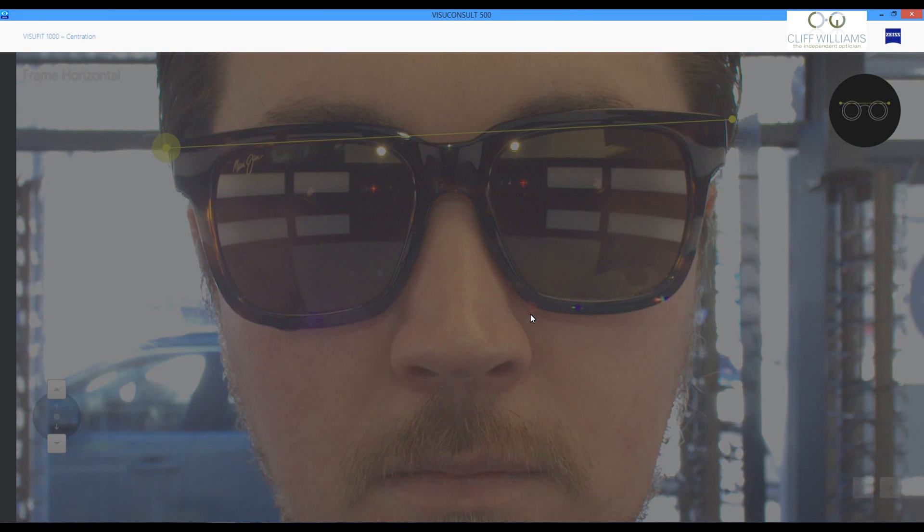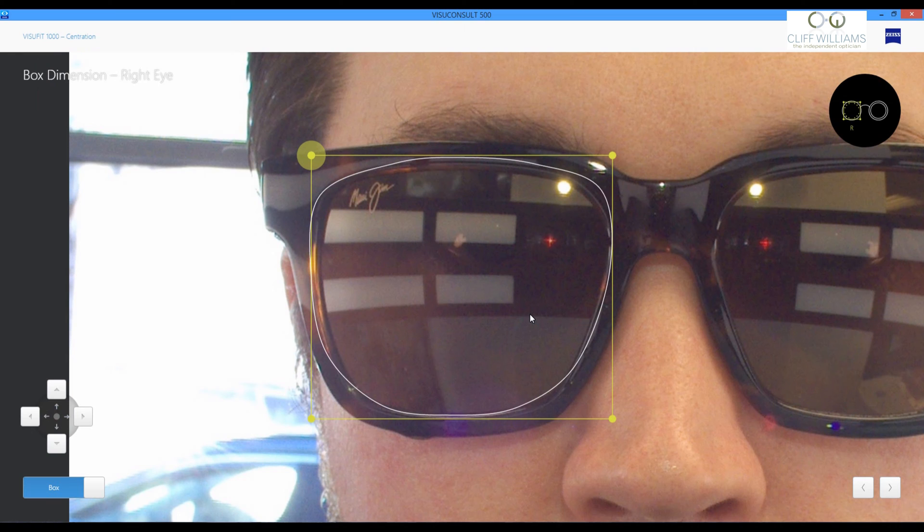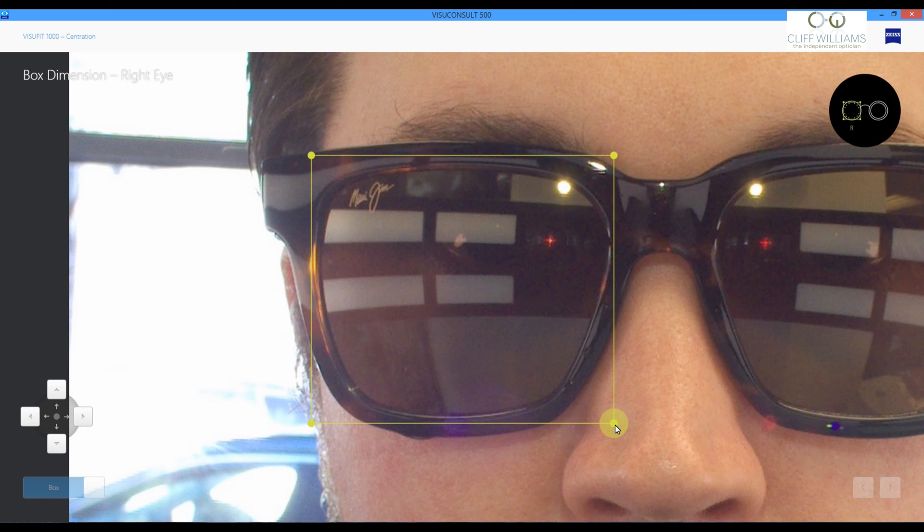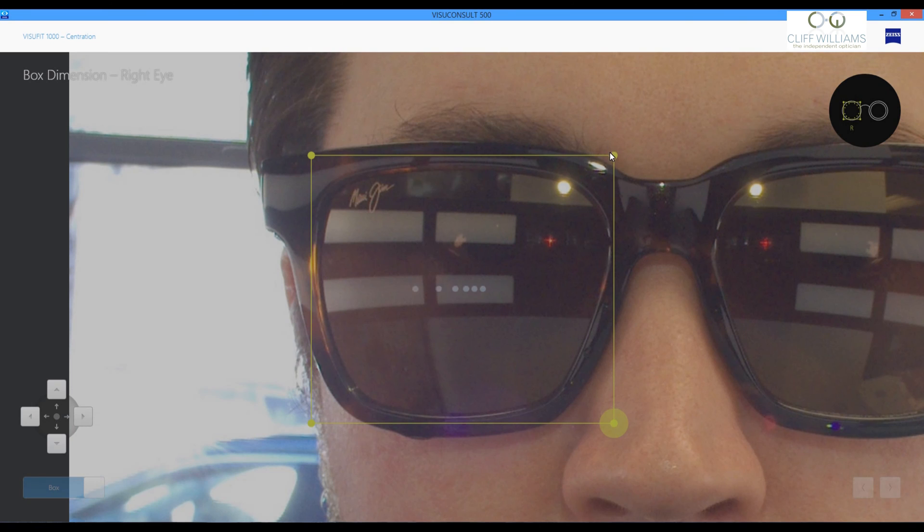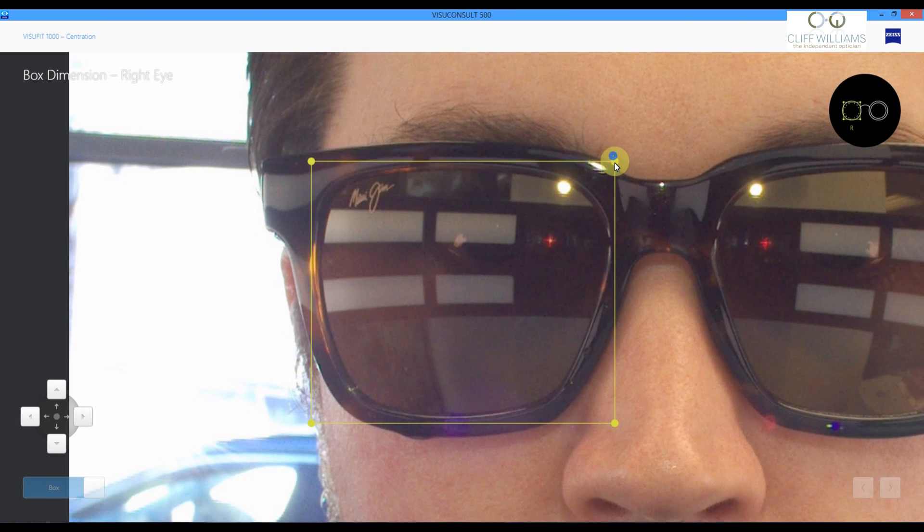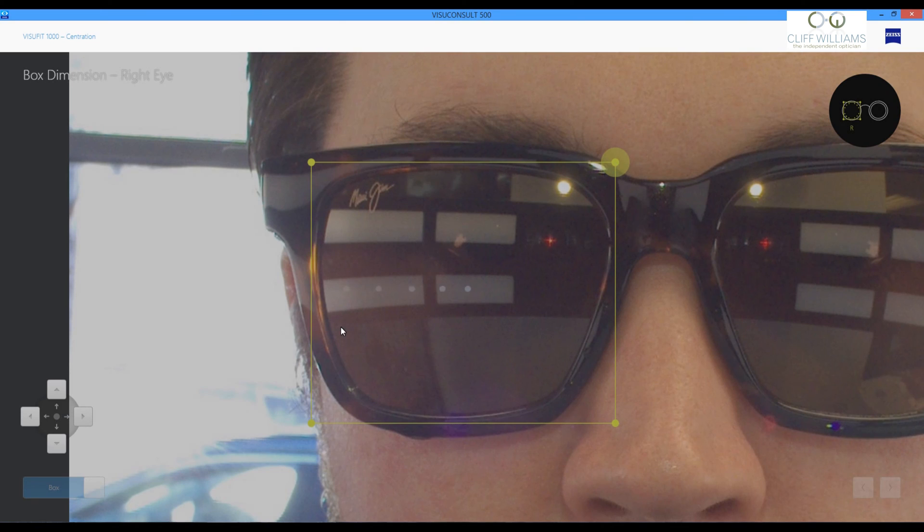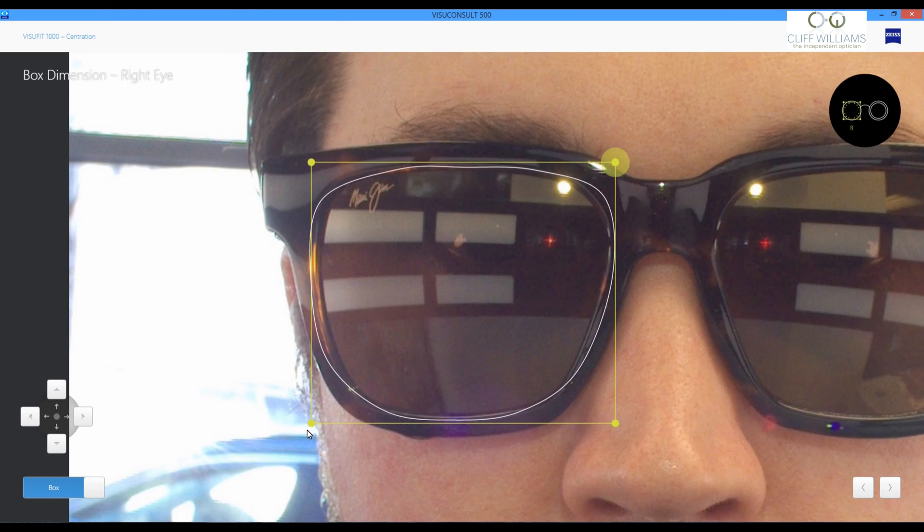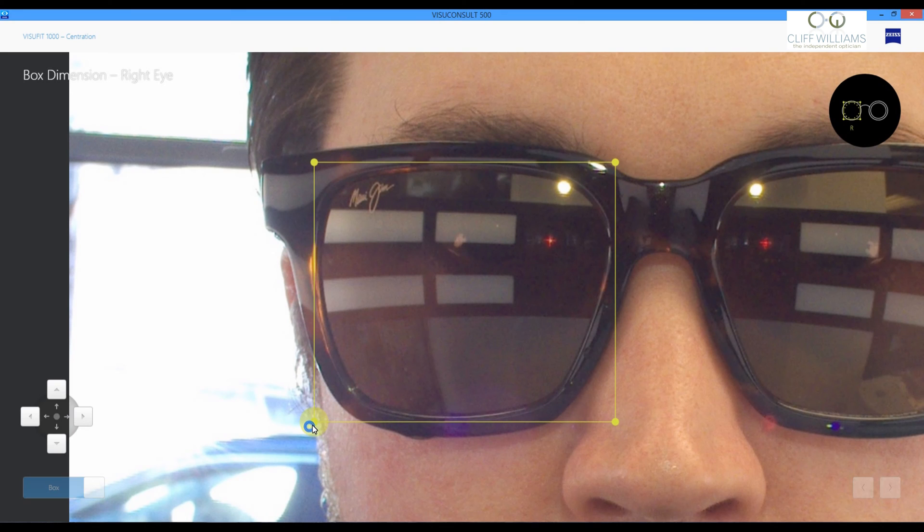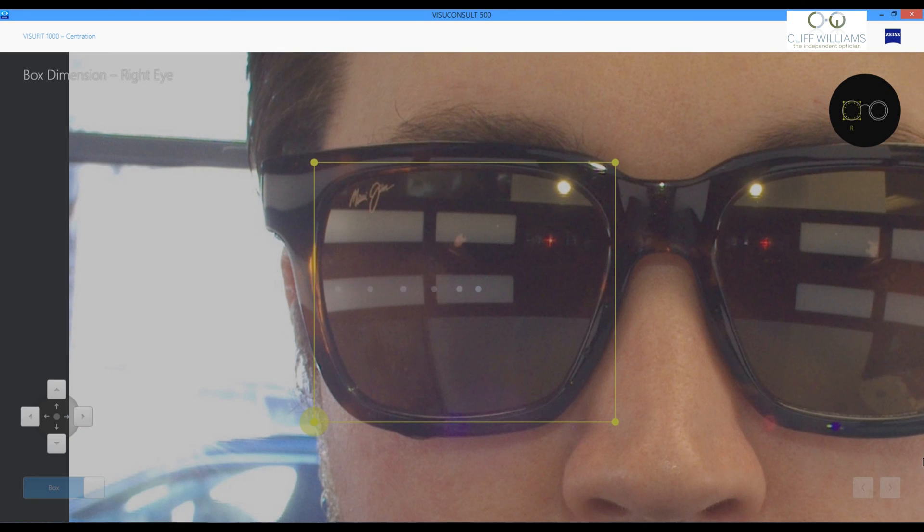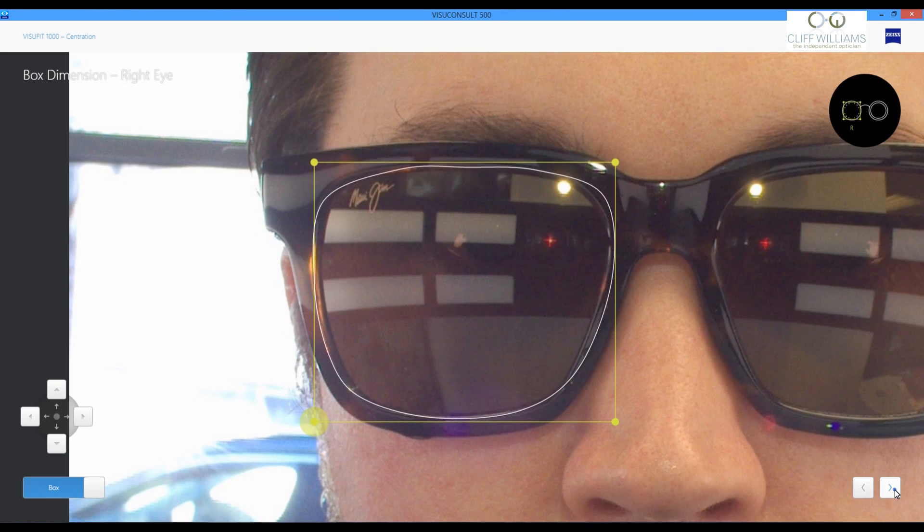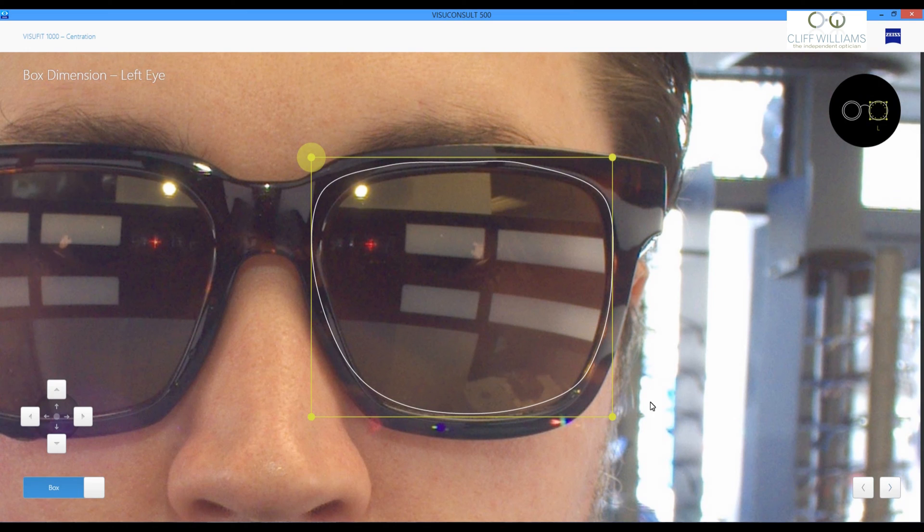We'll then draw a box around the lens. And this will allow the software to trace the lens aperture. We'll do this for both sides.